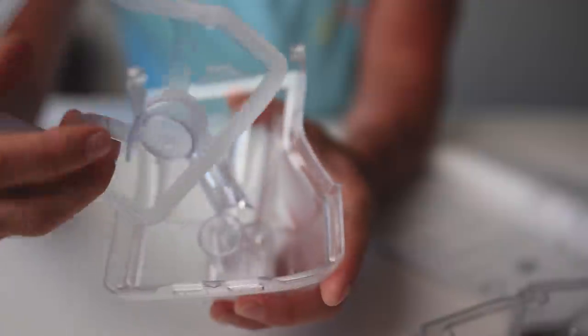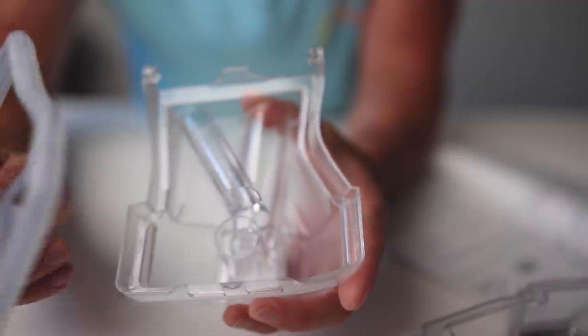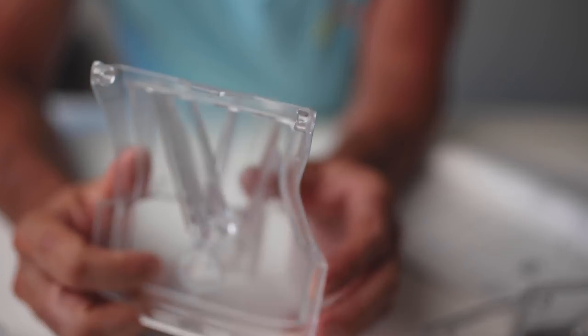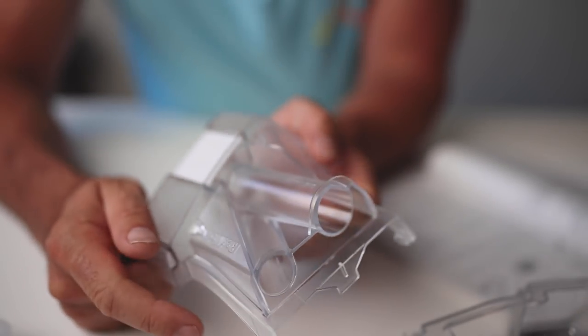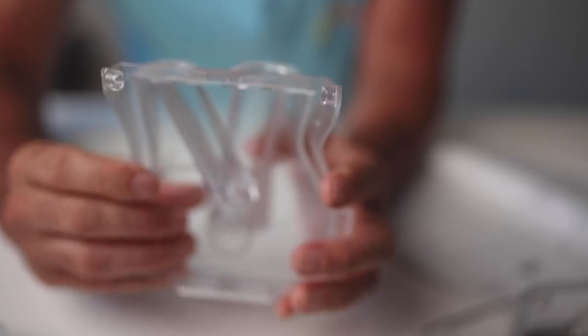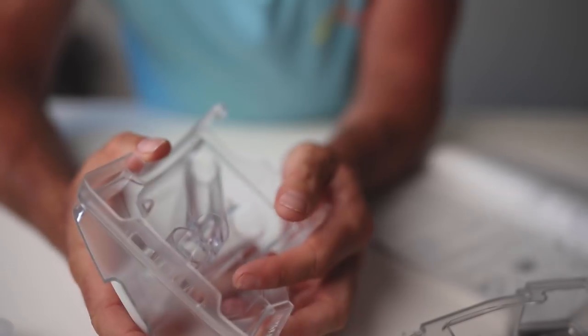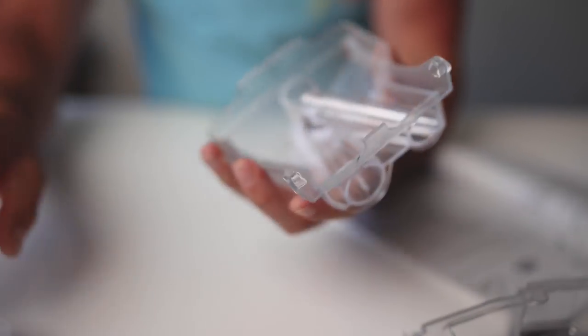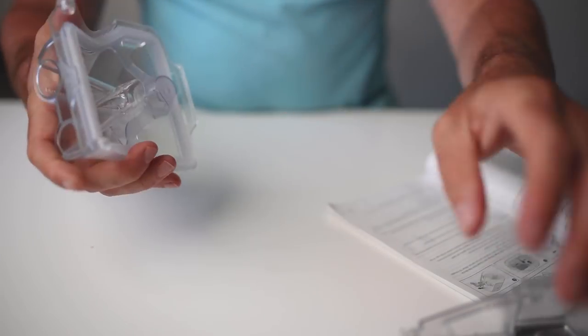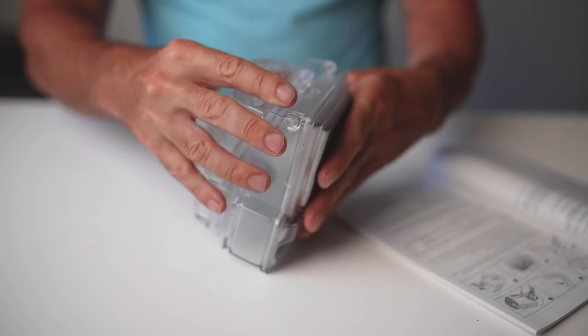The top section, this little part here, just peels off, there's no magic clips, and give that a wipe down. In here as well, if you've got a little tube brush, which all of you should have, you can run your little tube brush in through the holes and then once again just give it a little soak in some warm soapy water or in the vinegar as well. Pretty straightforward guys.